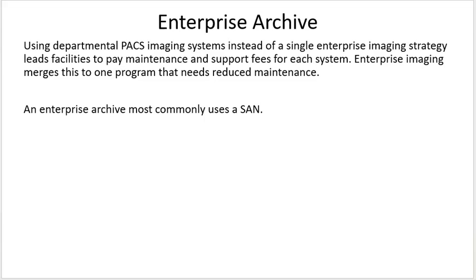Enterprise archive. Using departmental PACS imaging systems instead of a single enterprise imaging strategy leads facilities to pay maintenance and support fees for each system. So what PARCA is saying there is that if you have a radiology PACS, a cardiology PACS, an endoscopy PACS, a dental PACS, if you have 4 separate PACS systems and each system has its own archive, you have to maintain 4 archives, and they all have to pull up images for those patients.